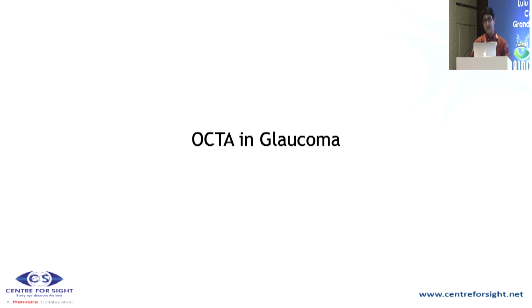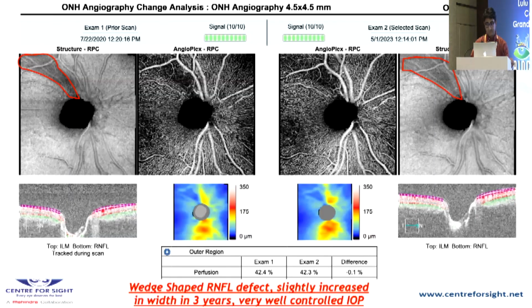So concluding, OCTA, even in vascular disorders, is really a good tool, especially in documenting the progression of the disease. And you can actually tell the patient how the disease is progressing, and it might need repeated treatment, the lasers or the injections, and you need to counsel the patient as per those indications.